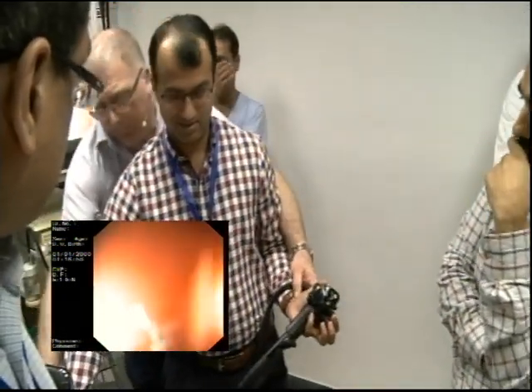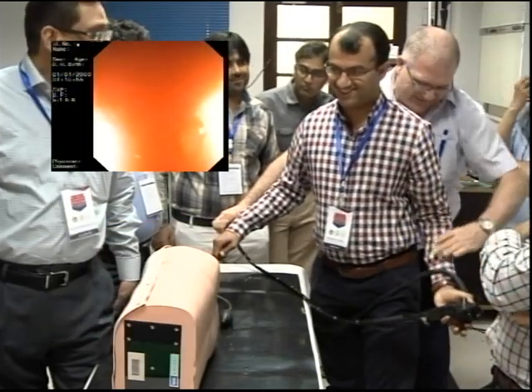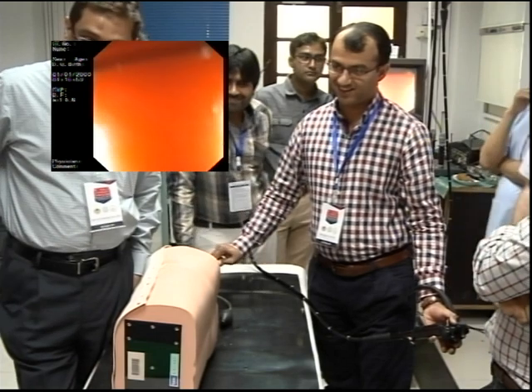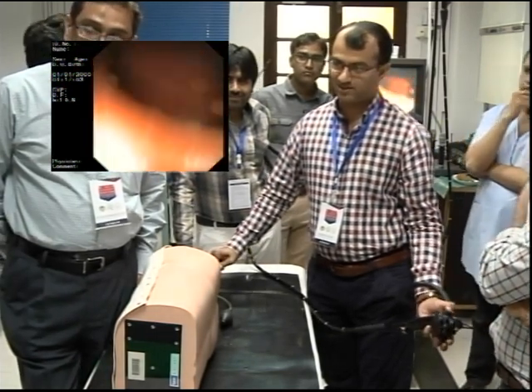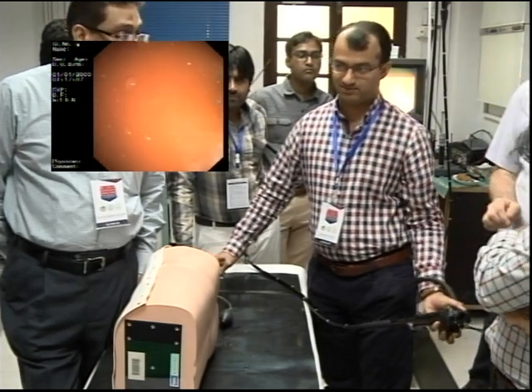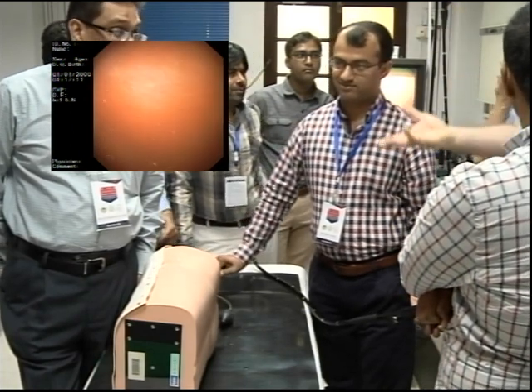Hold the scope and use this — you've got the scope. Hold it. Stop resisting. That's good. Now, tip up. See? So keep using your arms. Let the arms — the arms are an extension of what the scope does.